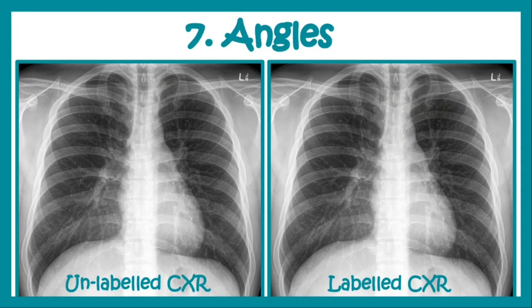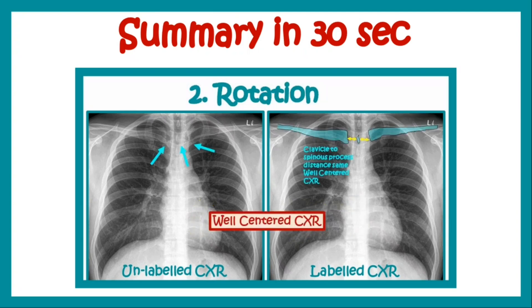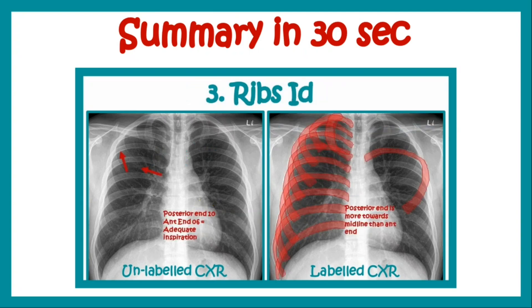Finally we look for the angles made by the diaphragm — that is the cardiophrenic angles and the costophrenic angles. In these angles we look for collection of fluid in case of hemothorax or pyothorax. So looking for costodiaphragmatic and cardiophrenic angles is also very important. This is what we learned in this video.